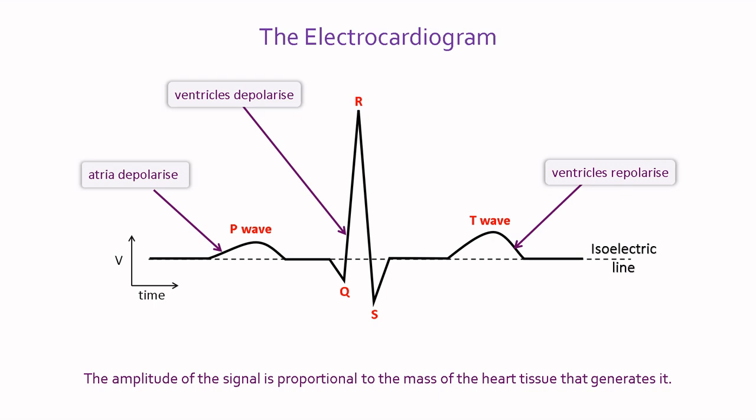You may wonder why ventricular depolarization and repolarization are detected as separate events in the ECG when they are continuous in an action potential. The reason is that the ECG detects changes in voltage between the two electrodes. During the plateau phase of the action potential, there is little change in membrane potential, so when depolarization is complete, the ECG returns to the isoelectric point.